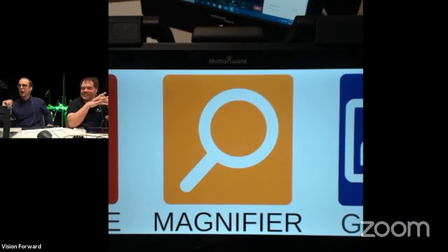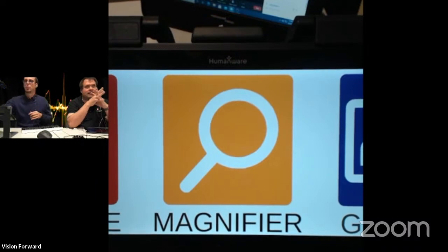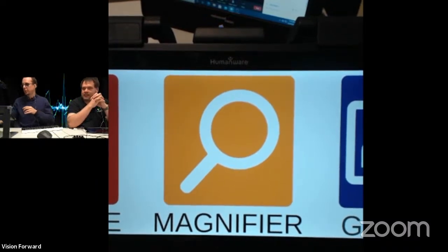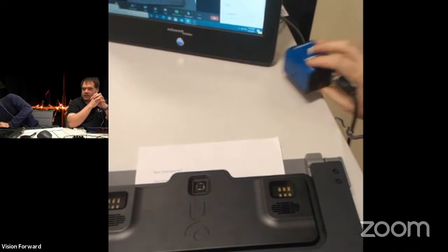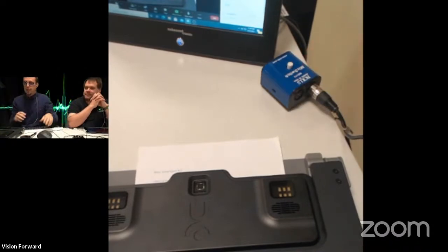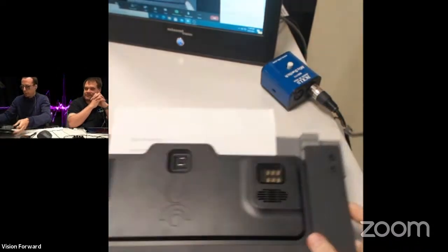All right, so that was a quick overview of the Connect 12. Please do check out youtube.com/infocus technology if you want to get a better, more in-depth idea. And you would want to watch the Reveal 16 video. Now the Reveal 16 is the Connect 12's big brother.